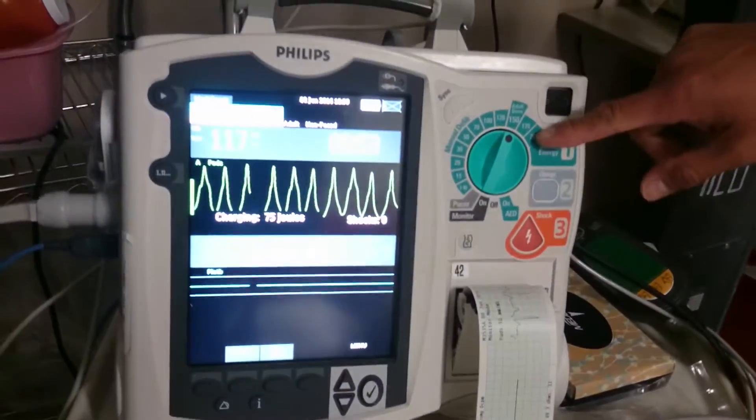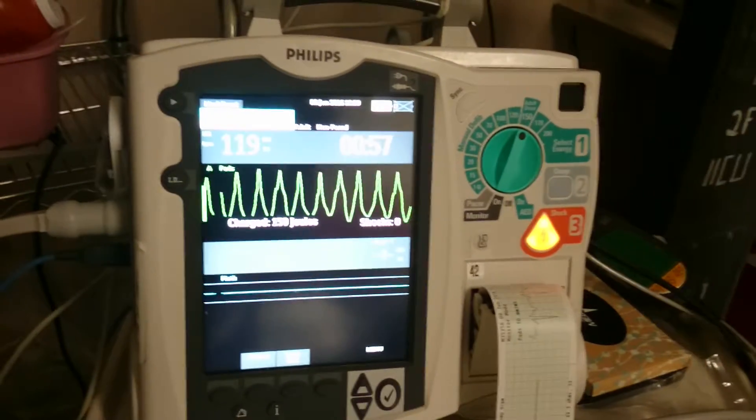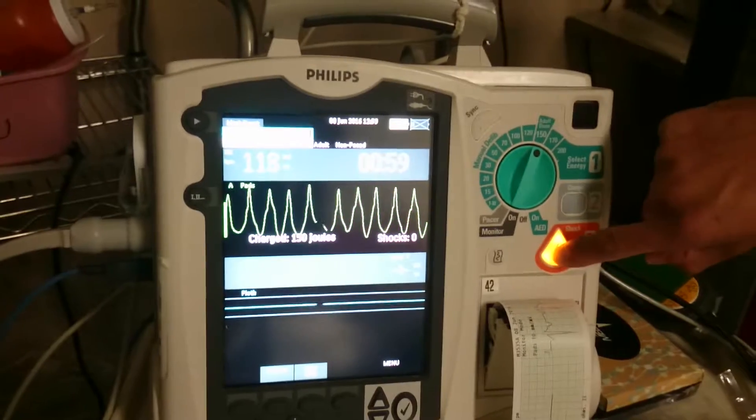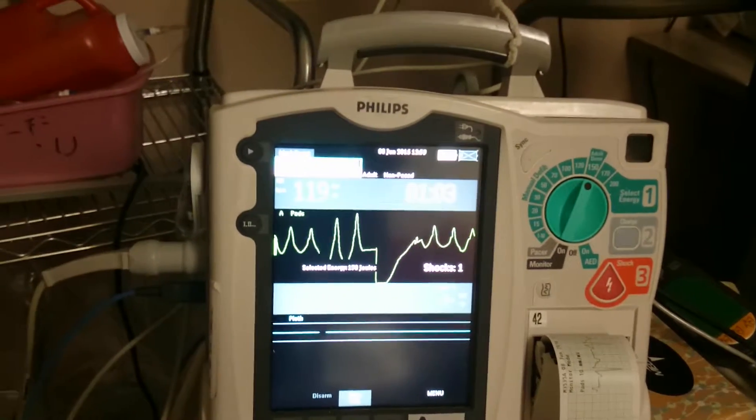This patient has no pulse, so we can charge and shock. We're going to defibrillate at 150. I'm going to charge to 150 — make sure everybody's clear, Brandon's clear, I'm clear — and then you hit the shock button. And that's defibrillation.